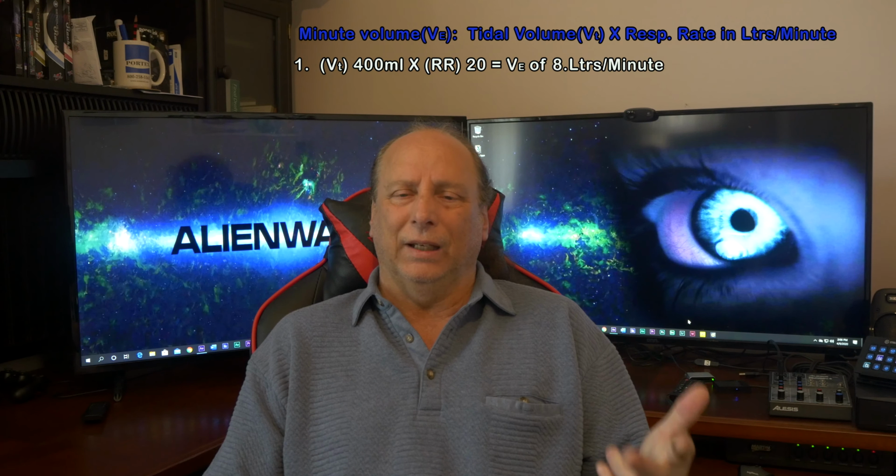Remember to wait a minute or two though to make sure you get the patient to cycle through so you can get a good minute volume. And real quick, just let me refresh what minute volume is. It's pretty simple, but I want to say it again. Minute volume is the tidal volume times your respiratory rate in a minute.